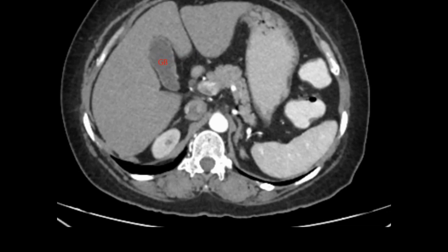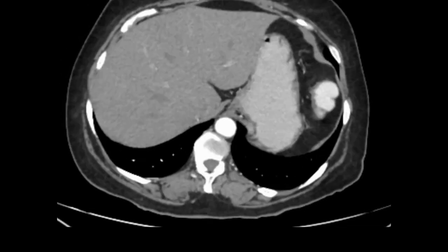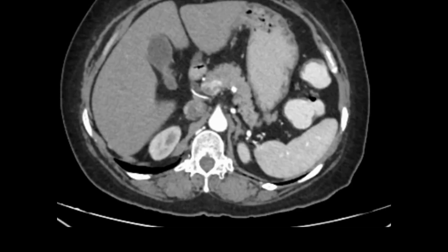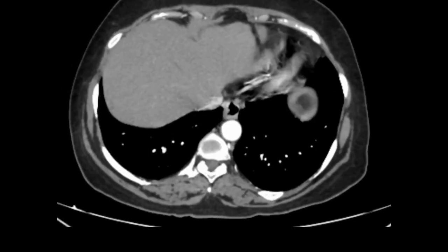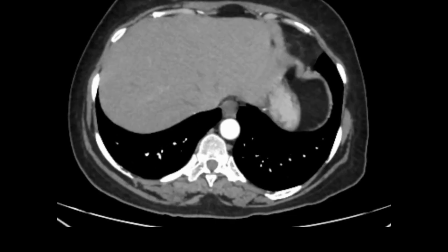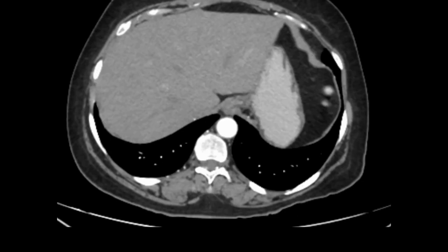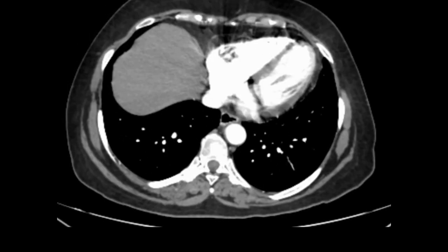This structure is the gallbladder. We have cleared two organs by now: the liver, and at the under surface of the liver starts the gallbladder. Now going back to the liver level, how to identify the vascular structures — the vascular structure anterior to the vertebra is similar in color to the heart. This is an arterial phase axial image and this structure is the aorta.